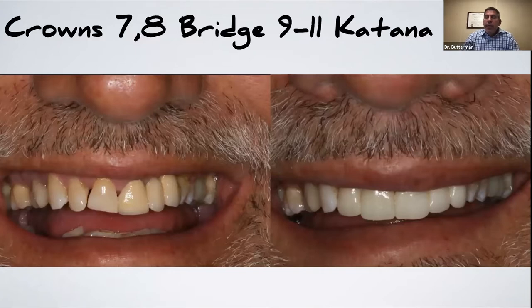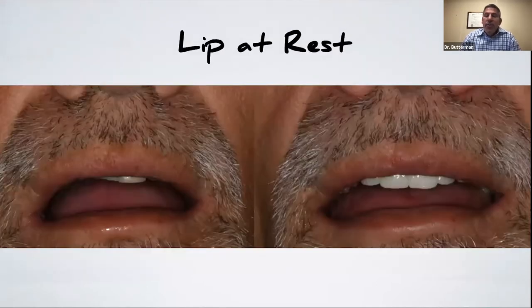So this is where we ended up with it. I've got a little bit of stain and glaze. I do have a polished surface here and a little bit of stain and glaze with it. So to my eye, I think we've got a restoration and the patient was really, really happy with that. I was really surprised with the translucency we ended up with. We've got a high strength material that was really, really nice and translucent. And this is the picture that I really like because this is his lip at rest now. And he's just sitting there with his lip just covering his teeth, just looks younger. And that's the comment that his wife made, is that I gave him a lot of years back by doing that.